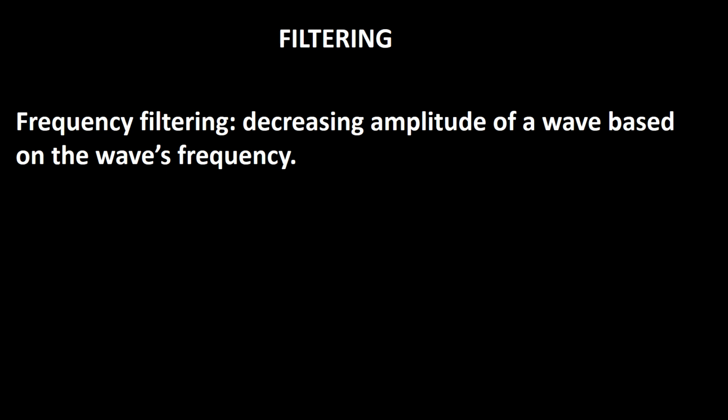This type of filtering is accomplished by the introduction of filters, mechanical or mathematical, into the EEG machine, and also by the effect of tissue, that is CSF, meninges, skull, and scalp, between the generator and the EEG recording electrode.